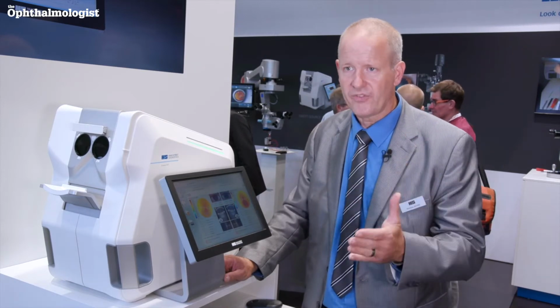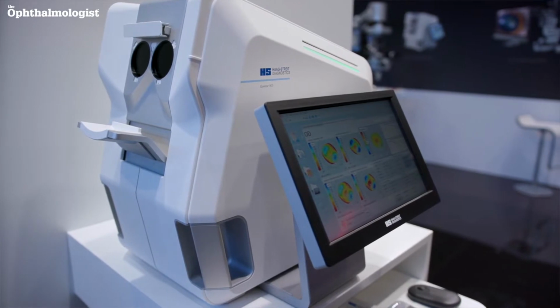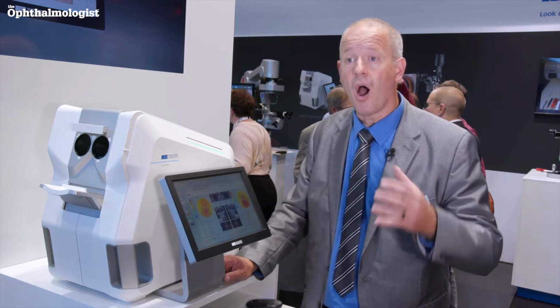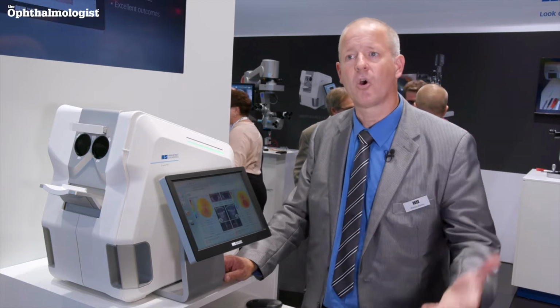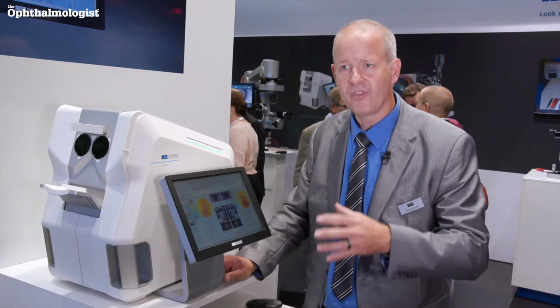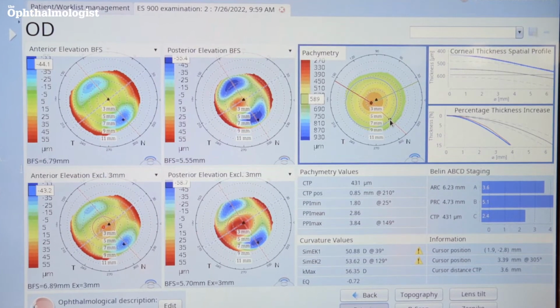topography from the anterior cornea, the posterior cornea, the anterior chamber, and you can also do visualization of the anterior chamber in OCT cross slides, which you can do after the data has been acquired. So there's no need to call in the patient again. If a slide is not at the exact right position, you can do it on the data which you already have, just shift it and get the slide again.